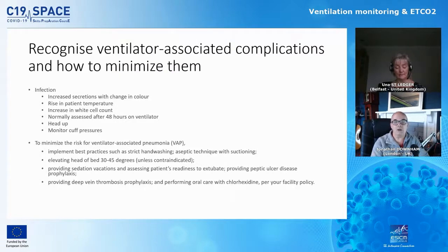So you can see there's a lot of things we need to cover when looking after patients on a ventilator. A lot of the things that we do are focused on minimizing the complications from a ventilator, and also assessing whether the patient is ready for extubation or whether we need to increase the amount of support that we're giving them.